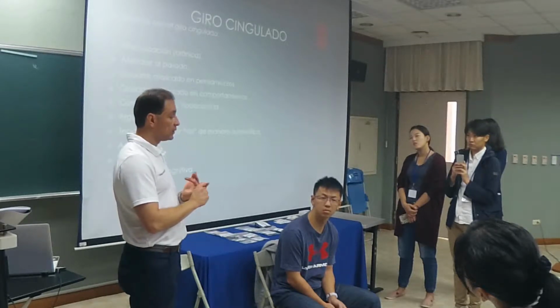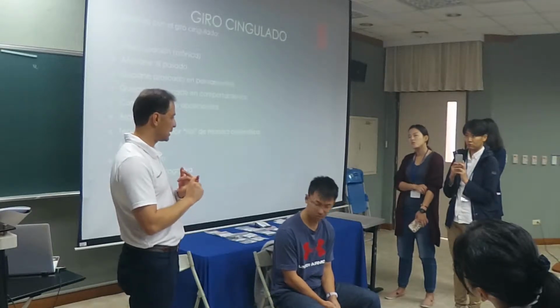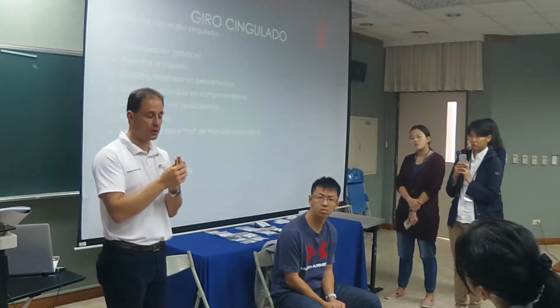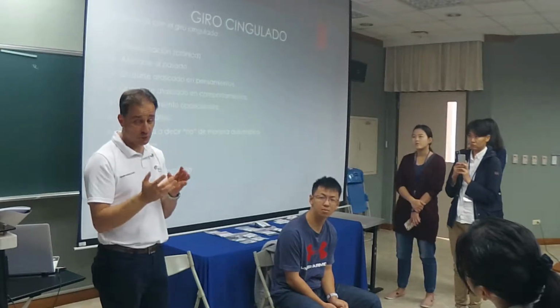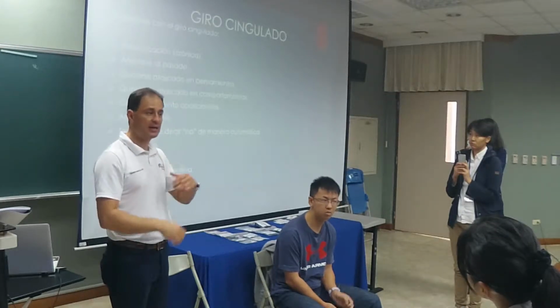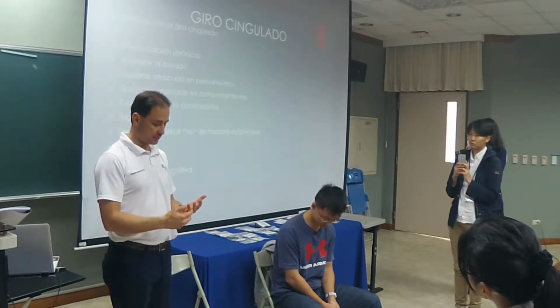Baseline, 2 minutes. Then we go into the stress 1 phase. Okay, and we stress him for 2 minutes, and I'll show you what we do. Then the recovery 1 phase. So after we stress him for 2 minutes, we're going to let him recover for another 2 minutes. And in the recovery phase, what I want to see is how fast he recovers and how well he recovers. So I'm seeing the client's recovering abilities, his self-efficacy to manage stress.